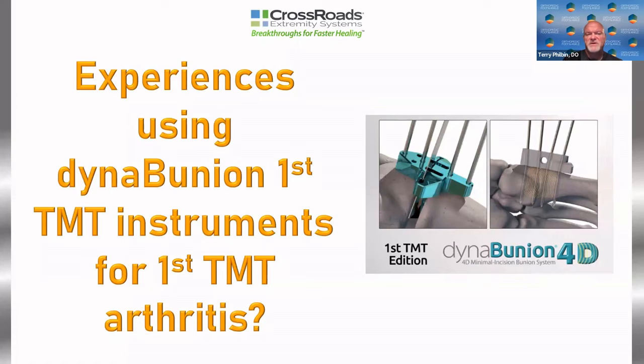All right. What are your experiences in using the dynaBunion first TMT instruments for first TMT arthritis? Well, I'll jump on this one first. That case I showed, that's exactly what I did. That last case that was up, and it's the easiest dynaBunion you're ever going to do. You don't have to really worry about the deformity correction. You're simply putting your cut guides on, making your cuts, preparing and compressing. So it's, quite frankly, about a 15-minute case, and it works just as well, I think, as dynaBunion does.